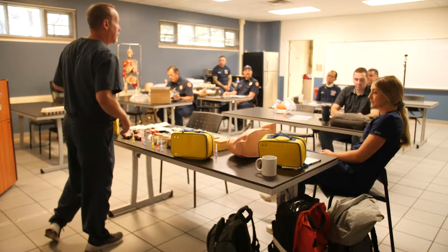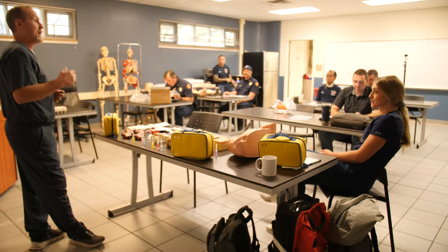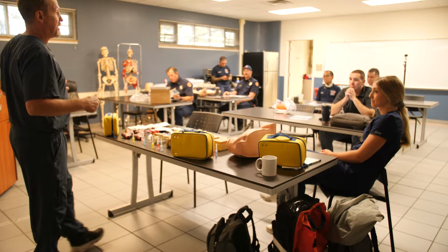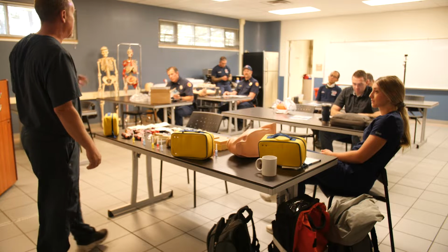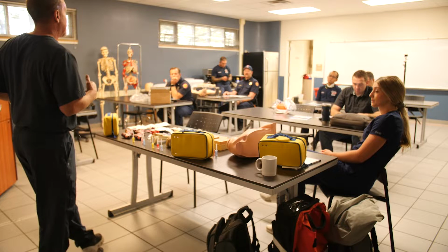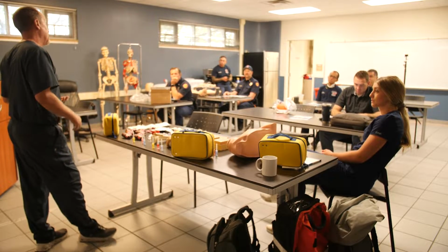Excellent. So we're going to talk a little bit about landmarking, the different sites on the human body where we can place this, and a little bit about adult and pediatric. On an adult patient, we have 6 locations. We go to the proximal humerus, the proximal tibia, and the distal tibia. I'll go over landmarking on these areas in just a minute, and we'll do it a little interactively. But of those sites, the best place to put this into a patient is going to be the proximal humerus, and there are a couple of reasons for that.